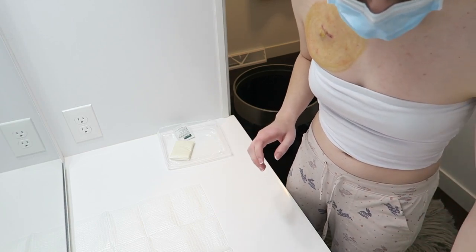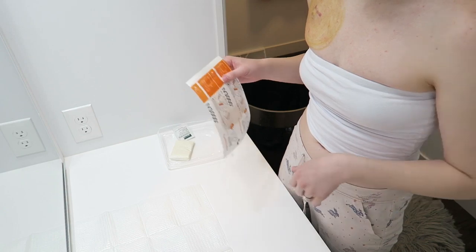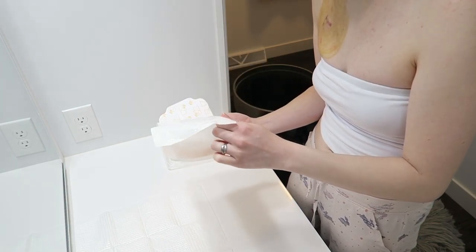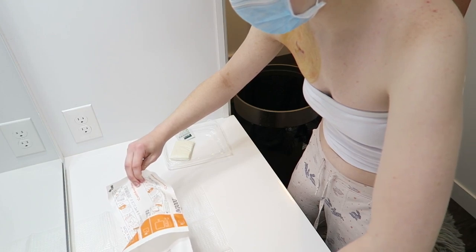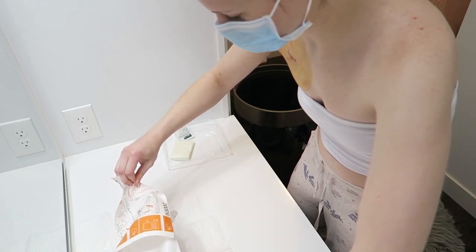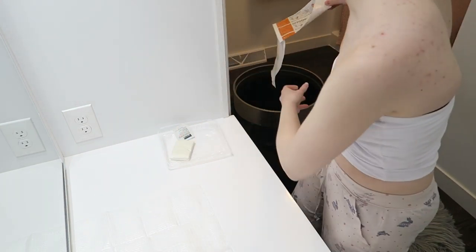All right, first thing is we're gonna take our IV3000 and put it onto the sterile field. So we're gonna open it up, and do not touch anything inside. And then we're gonna set it on the sterile field, just like that, and then throw the wrapper away.